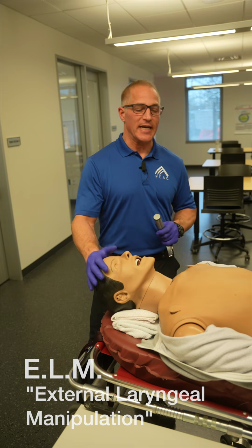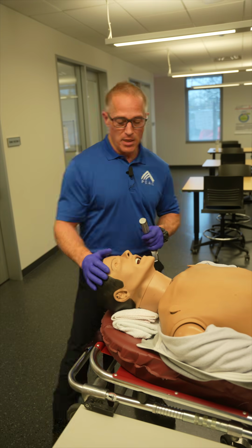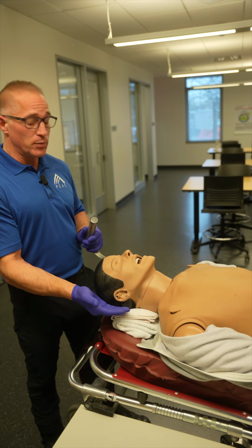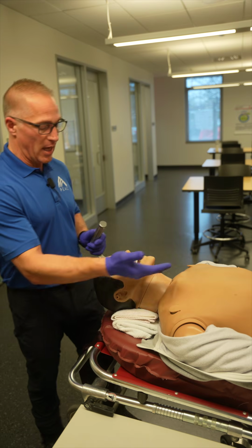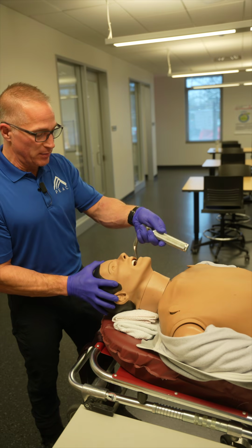The last piece in our dynamic airway positioning is ELM, external laryngeal manipulation. I have the patient in a flextension position. As you can see, the ear hole is aligned with the sternal notch. Within this position, I can now attempt intubation.